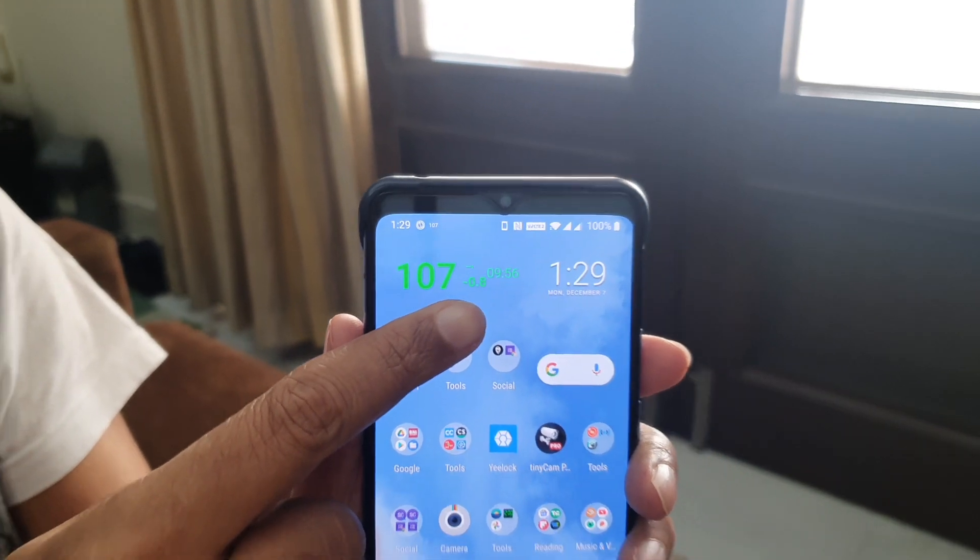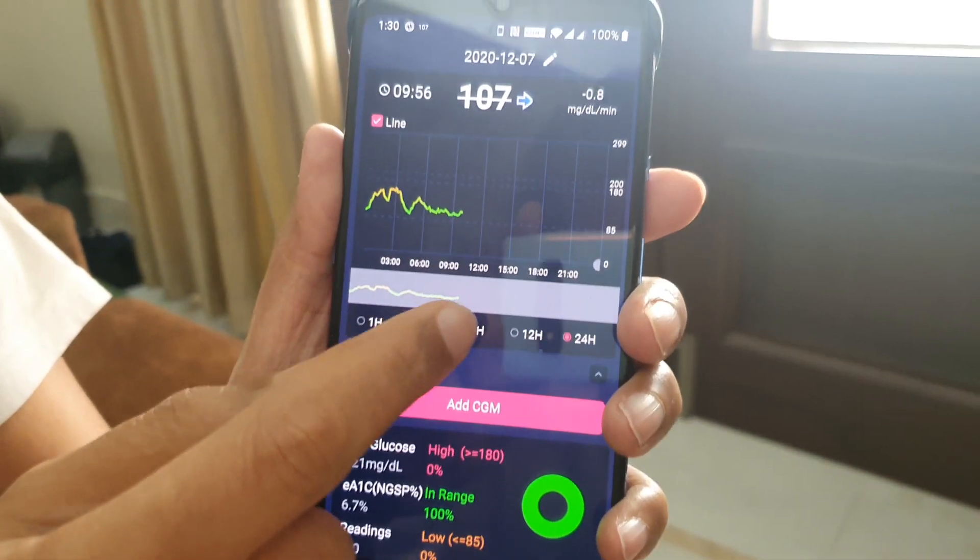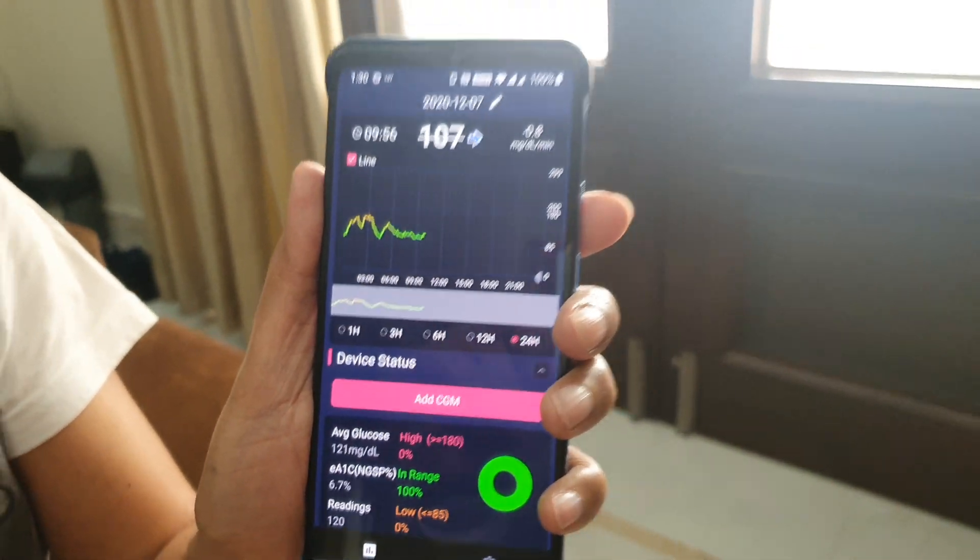If you do open an app, you can see the complete values. I will do a separate video on the app and how to configure alarms, but the important thing is that this is very, very convenient and makes it a completely different ball game.